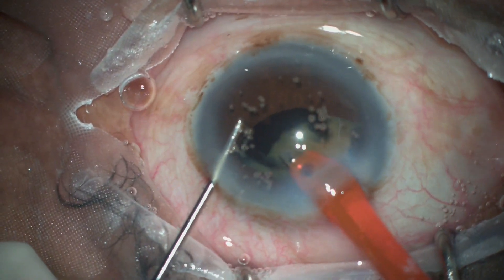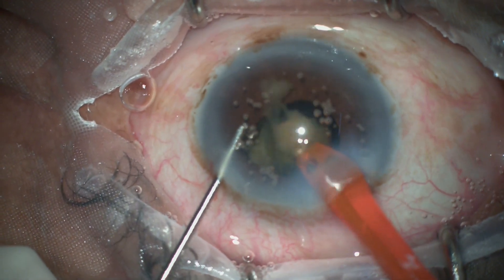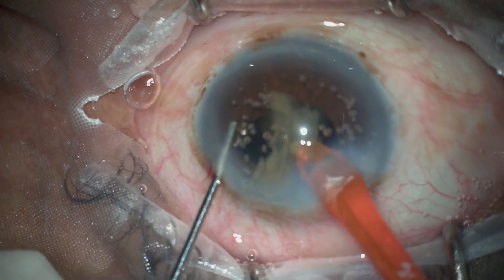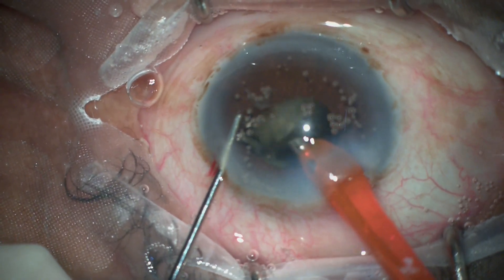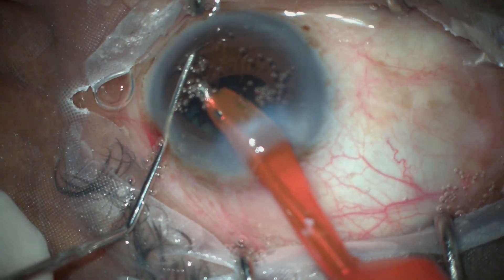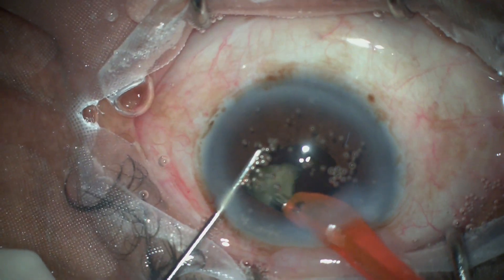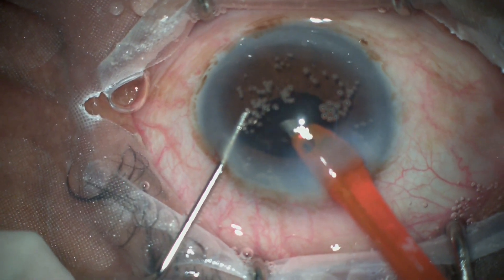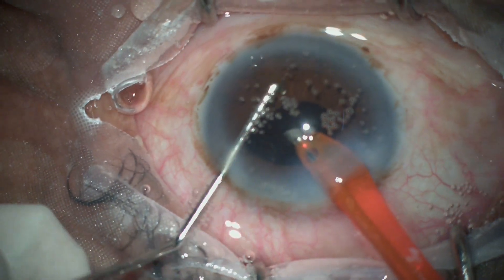This is a free piece floating around, demonstrating this phenomenon well. As phacoemulsification proceeds, care must be taken because the pupil is getting small — the iris should not be damaged. All work must be performed at the center of the pupil, keeping watch so the iris is not caught.